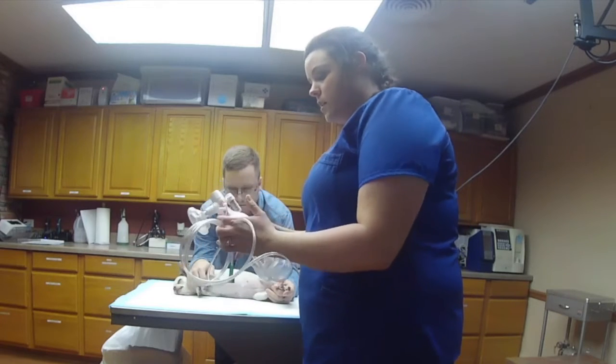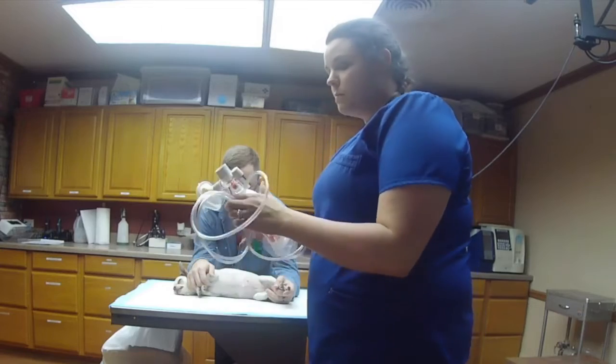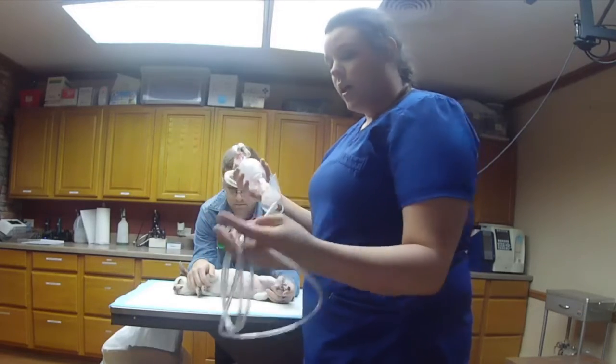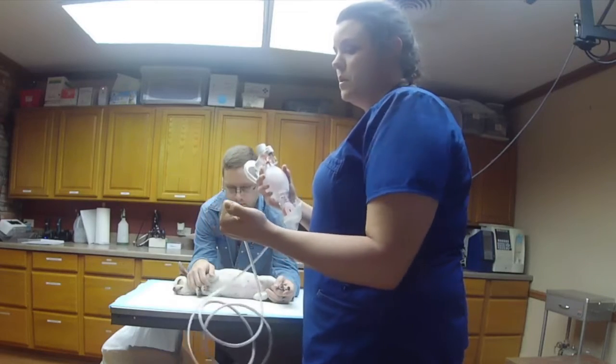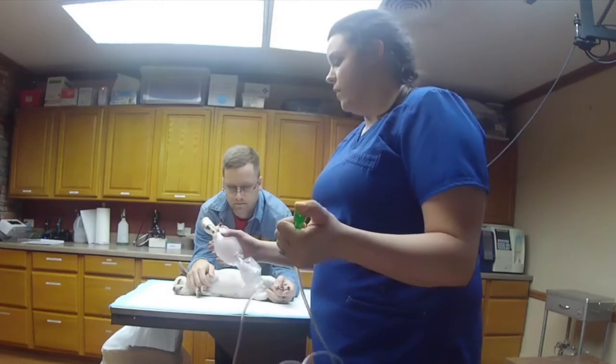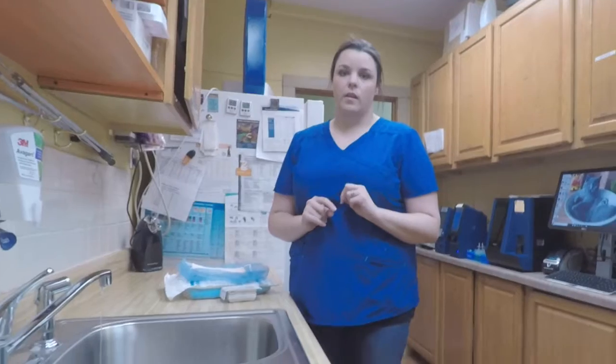But if not, this is an ambu bag. You would hook it up to their muzzle, and hopefully by now you'd have the trach tube in. You would hook this piece into the oxygen, and it would give oxygen directly to your patient. You can let her up.